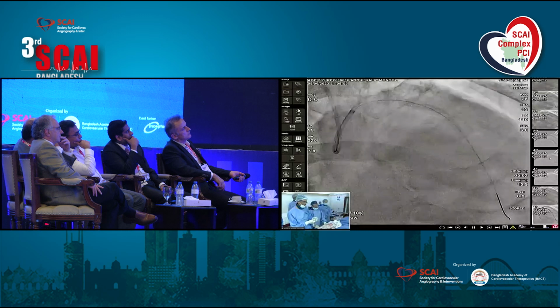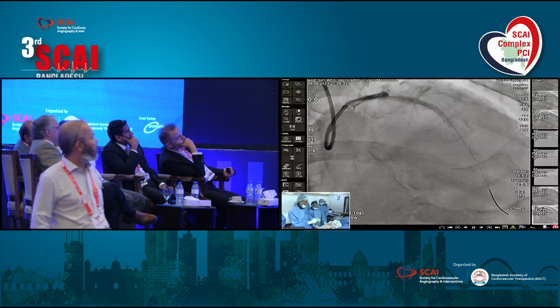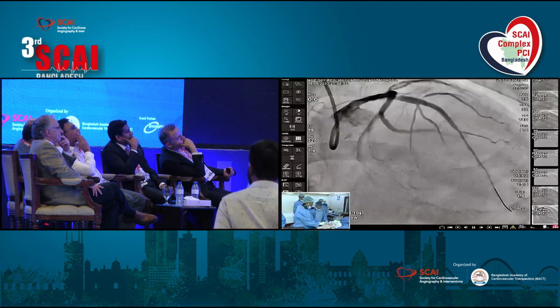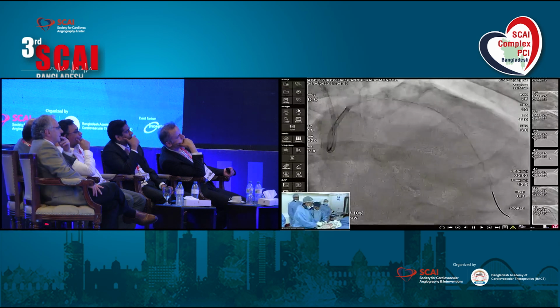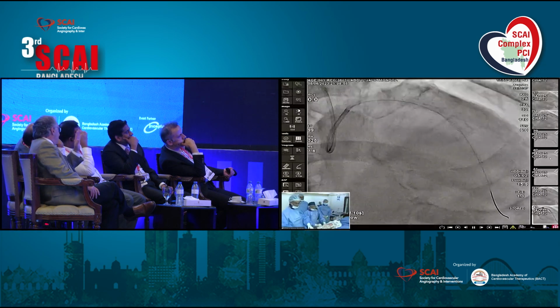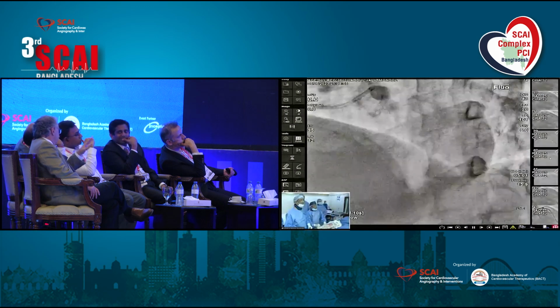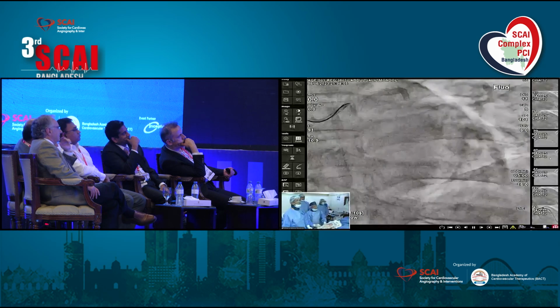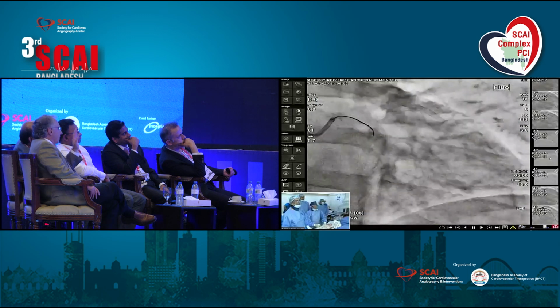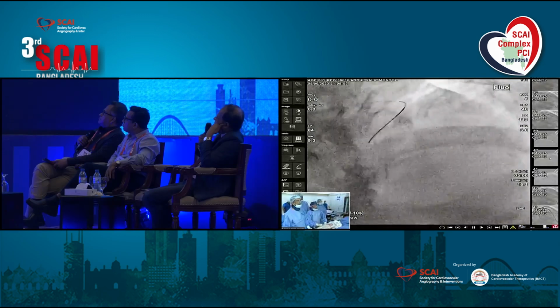Excellent. Sir, how is the renal function? Is it okay? Yes, okay. And how much contrast have you used by this time? Till now, 60 ml. Quite reasonable. So angiographically, the stent distally seems to be over dilated, but I think the vessel is actually underfilled distally rather than over dilatation of the stent.